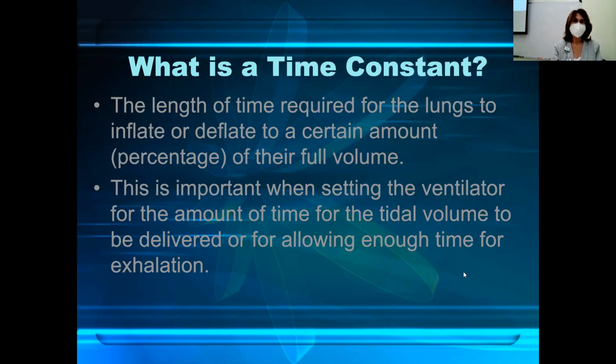Why do we care about time constants? It says this is important when setting the ventilator for the amount of time for the tidal volume to be delivered, or we keep it in mind for allowing enough time for exhalation. So the amount of time for the tidal volume to be delivered is the inspiration. So we want to make sure the inspiration is long enough to get the volume into the lungs. And we call that the time constant.